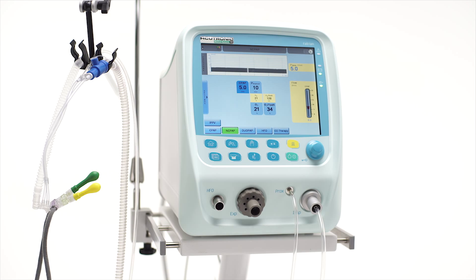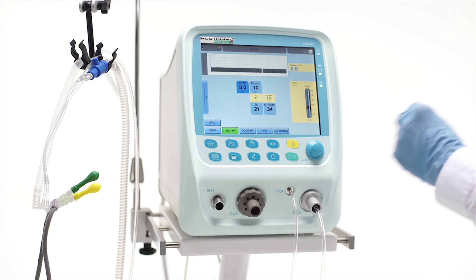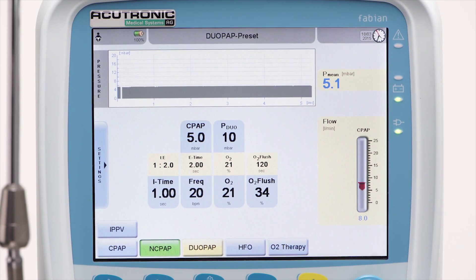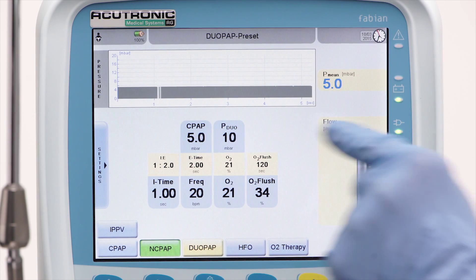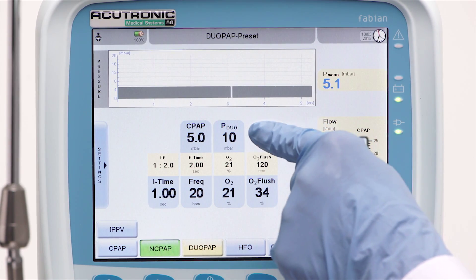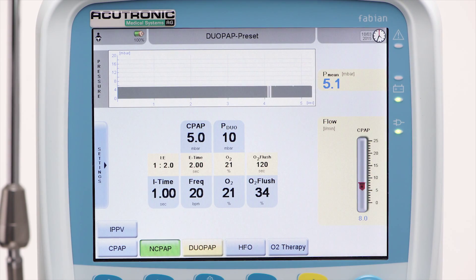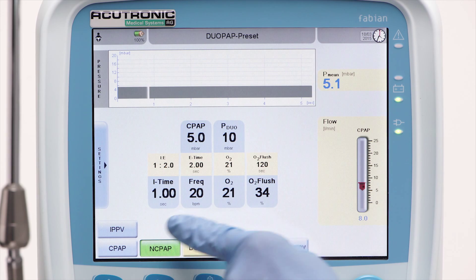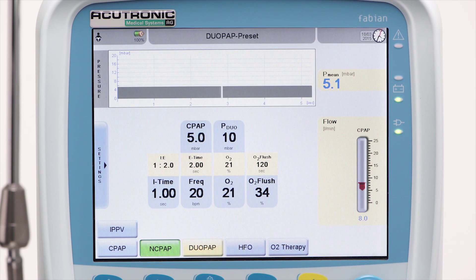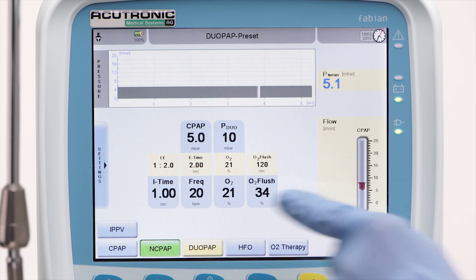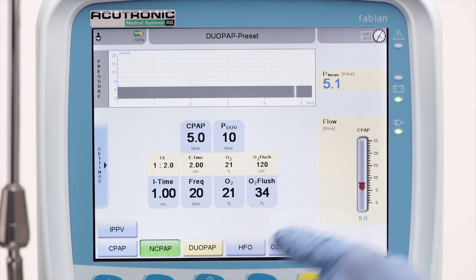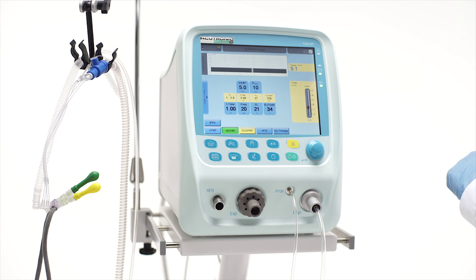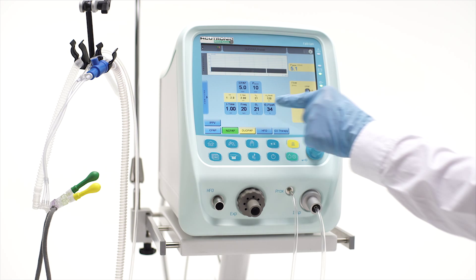In addition to the NC-PAP mode, the DUO-PAP modality offers non-invasive ventilation on two different pressure levels and therefore may be beneficial to increase the ETCO2 washout, or act as a mode with a fixed number of breaths to stimulate babies with increased apnea events.